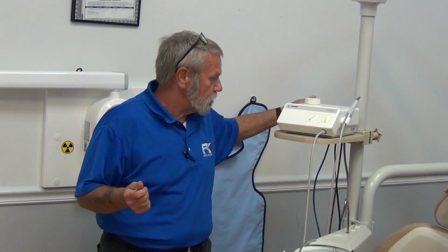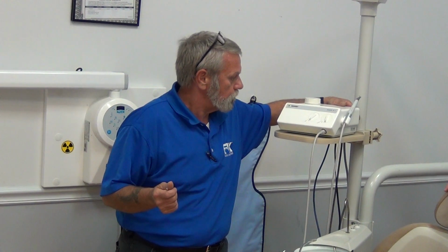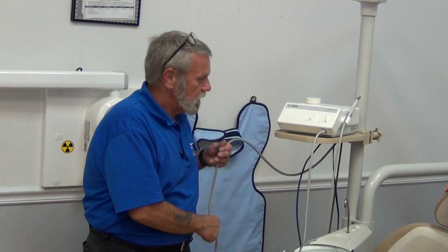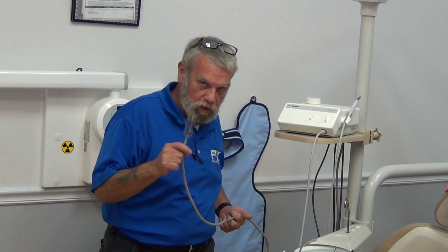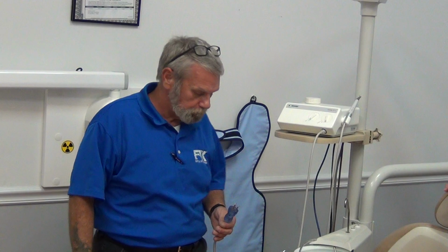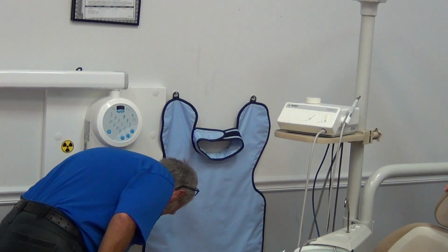My unit won't come on, even with the switch on the back. The first thing that we should check is whether the unit is plugged in. Sometimes the plugs are going to be hidden, especially when you have a mounting situation like this. Sometimes the plugs will be down in the J-box or the junction box on the floor. Get down on your hands and knees and check where it's plugged in. This unit was not plugged in. We're going to plug it into the wall.